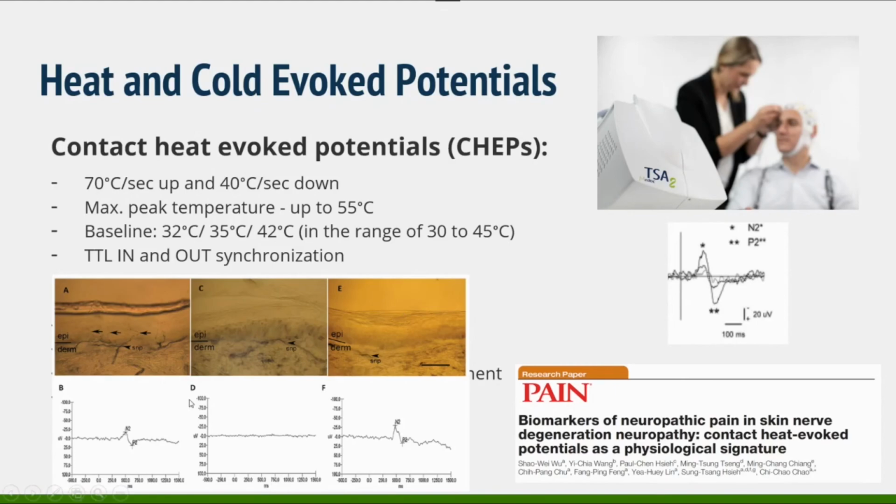And the third patient is very interesting. So you can see in the biopsy that the biopsy is abnormal, but this patient actually had evoked pain as a result of mechanical painful stimulation. And you can see that the evoked potential exists, and there is some amplitude that can be measured, etc.